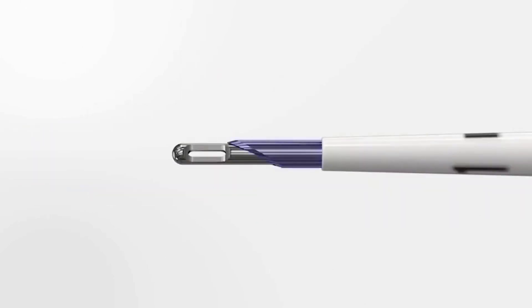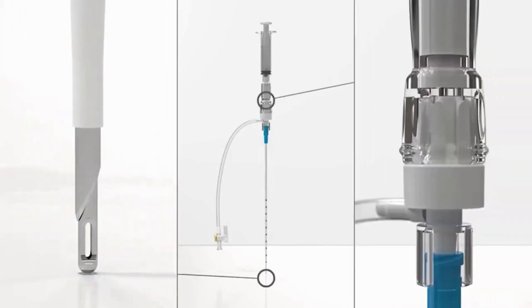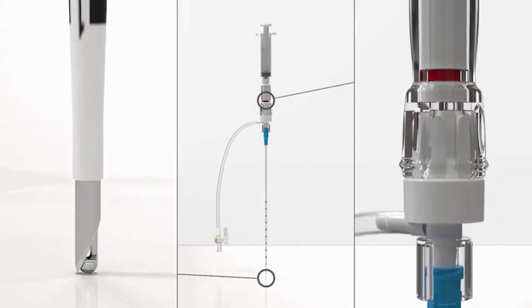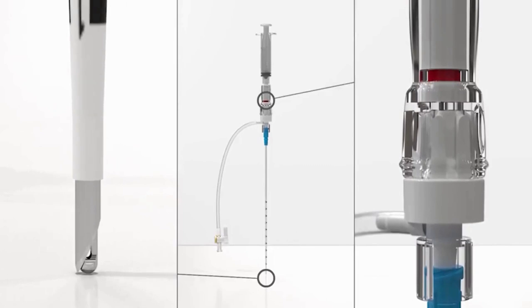Verify the sharp portion of the introducer needle is extended beyond the catheter tip. Confirm the Safety Centesis device is assembled properly by testing it on a sterile field. Gently exert downward pressure on the tip of the introducer needle — the color change indicator should transition from safe white to caution red, indicating that the blunt obturator is unlocked and can move freely.